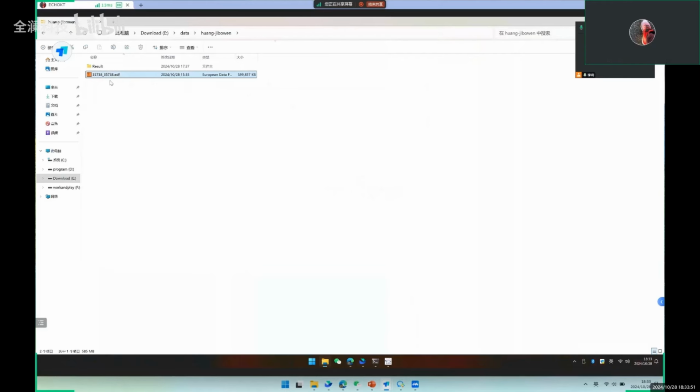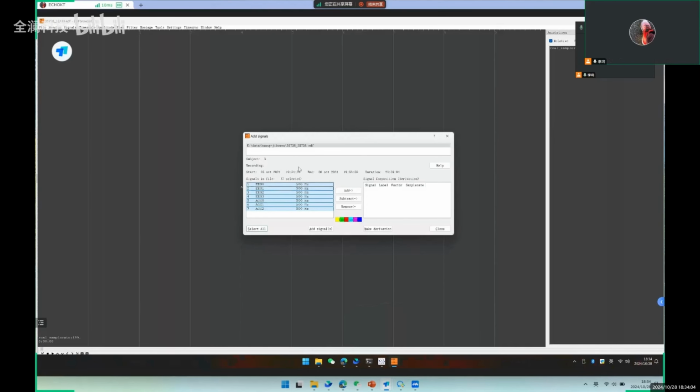First of all, you need to prepare the data in EDF format before using the software. This is an open source software, which is used to analyze the data of wireless in vivo electrophysiological telemetry systems. Open this software. Let me briefly introduce the interface of this software.